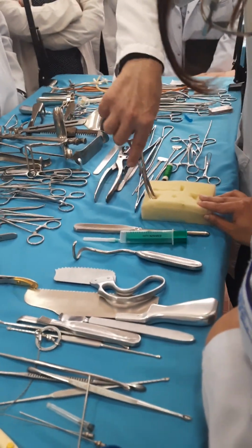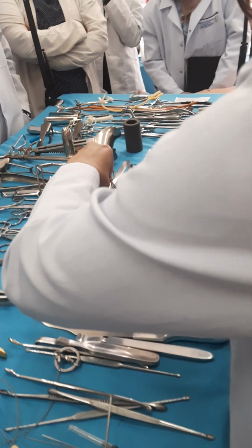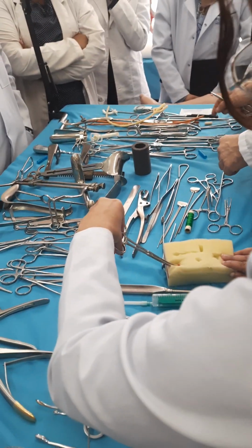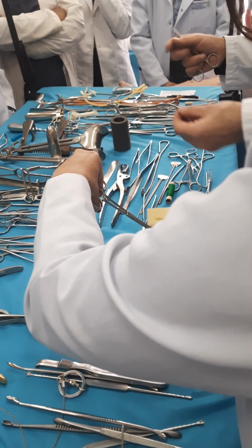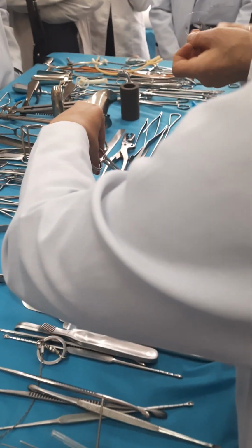Or, what else can I do? Again, hold it, please. I can make the ligation with suturing. Ligation with suturing. What does it mean? I take the needle.